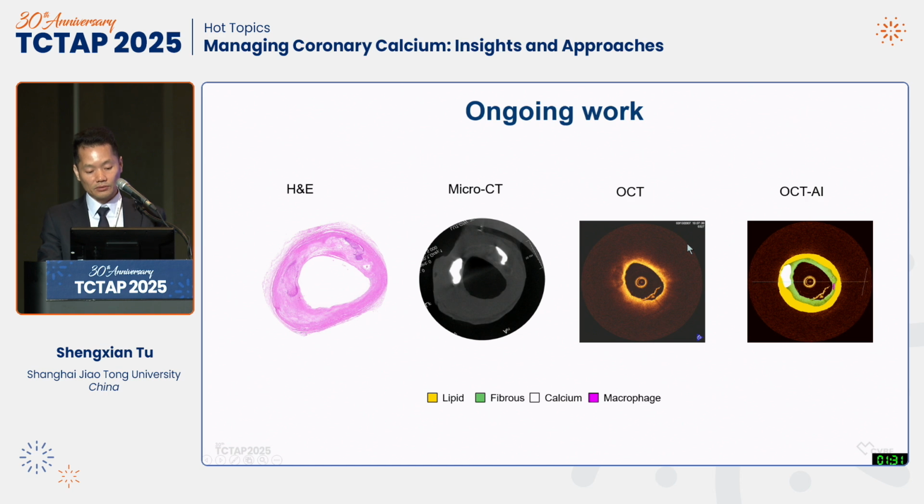And also we further look into some studies that are ongoing. So we have some postmortem studies where we look at the histology and micro-CT and OCT as well.